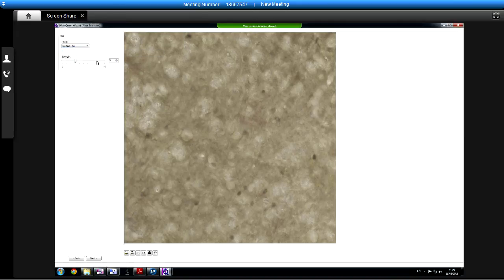Okay. So on the next screen, we get on to actually identifying what it is we want to count or quantify. There's two principles really. Number one is layers. In histoquant, you have multiple layers. If you play with Photoshop or something, you get the concept of different layers. Each layer is a different thing that you're counting or quantifying that you might want different data about. You can have one layer, or several layers, and within that layer, the primary way you're identifying the object is on colour, and then secondarily, there's a little bit of filtering them down by the size as well.